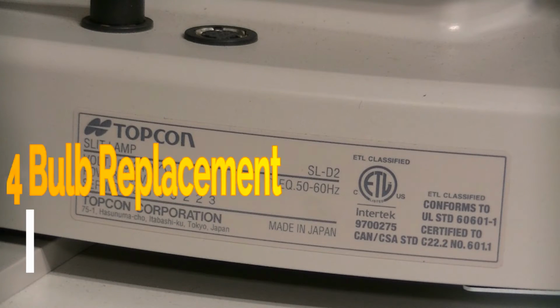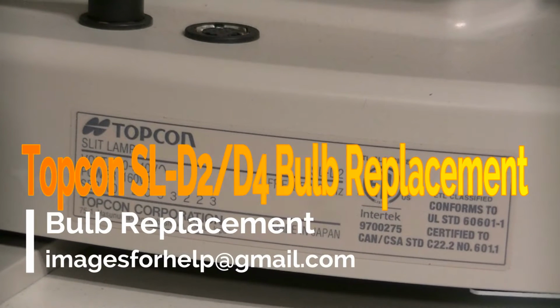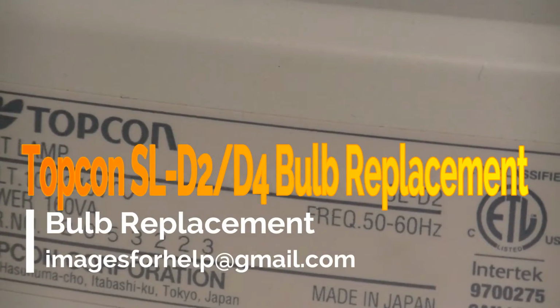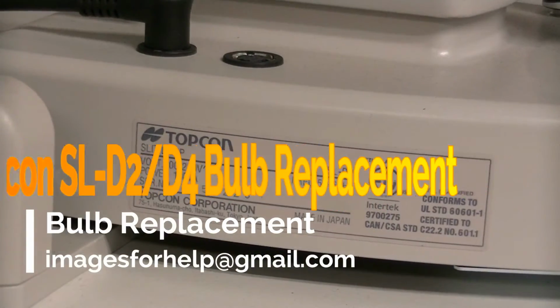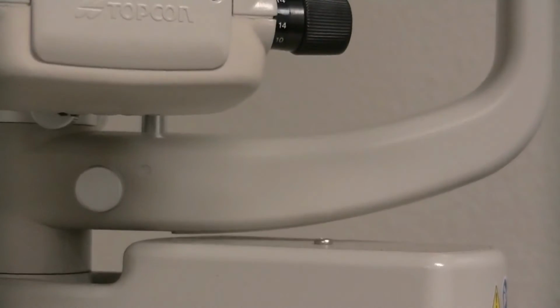Okay, this is going to be a tutorial on the Topcon SL-D2 slit lamp bulb replacement. It's not very easy to do. It's one of the hardest slit lamps you can do. So what we're going to do is show you how to do this the best I can and do the edits the best I can.